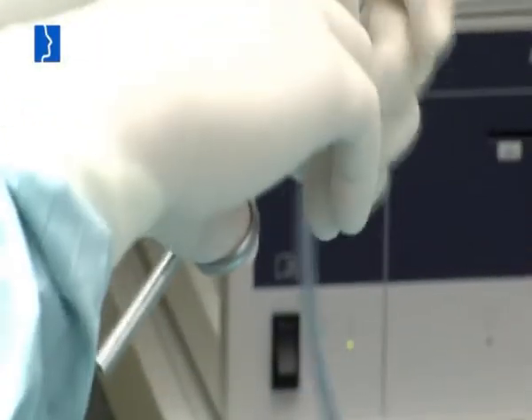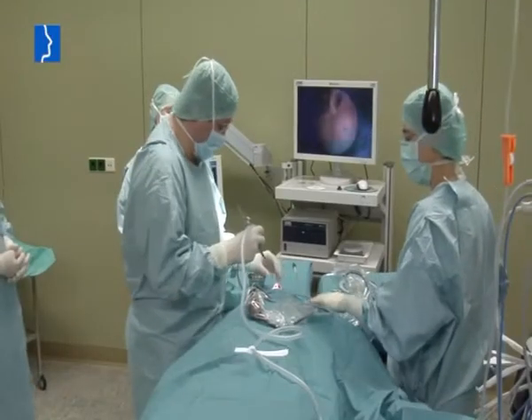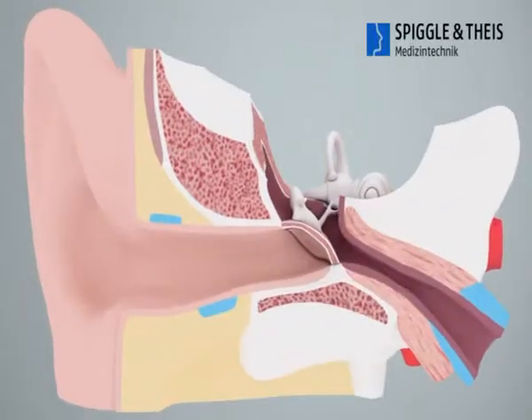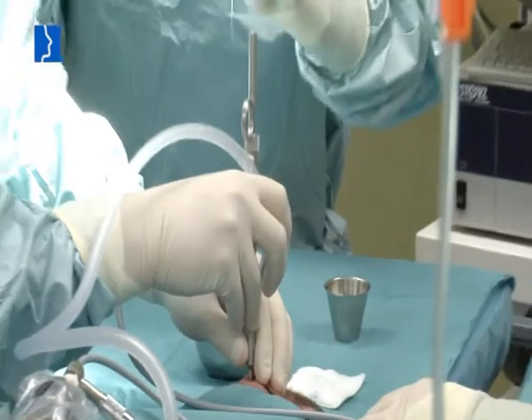The special feature of the new method is that it is minimally invasive, that it can be performed in a short period of time, and that essential physiological conditions can be restored with a minimum of effort. For the operation, I first perform a nasal endoscopy. This means going into the nose with a light rod, looking at the anatomical structures and checking for the presence of mechanical obstacles that may also be contributing to the functional disorder of the eustachian tube.